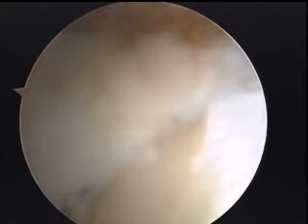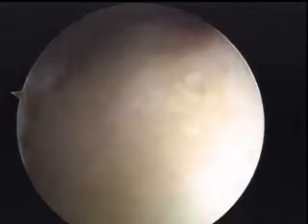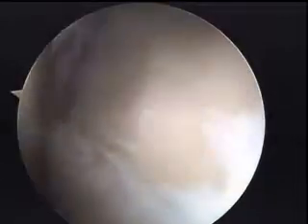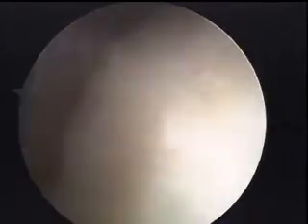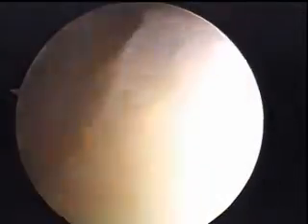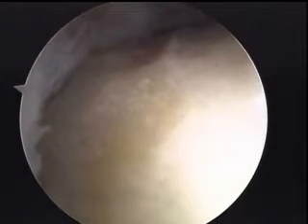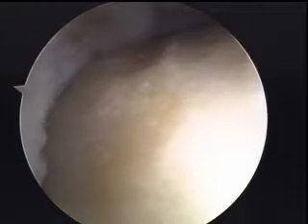In addition to using the special X-ray, we'll also switch portals once in a while to view this resection from basically that portal up there, to assure that we're getting all the way down here and getting a different perspective. That still needs a little bit right there. All the way back, you can see where it still goes down right there. That's where it should be down to. So we'll clean that off a little bit, again using our X-rays to ensure that we're getting where we need to. And we'll switch back to our burr and continue resecting this area.